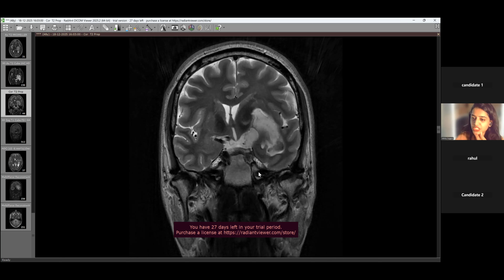In the DISH case, that was diffuse idiopathic skeletal hyperostosis, and you picked it up well after seeing the cervical spine. But if you're in doubt, you can say I would correlate with a radiograph or CT of this patient if it was there. And I think you mentioned the part about cord compression. I'm not sure because your voice kept getting cut in between. Yes, cord compression, so urgent referral.